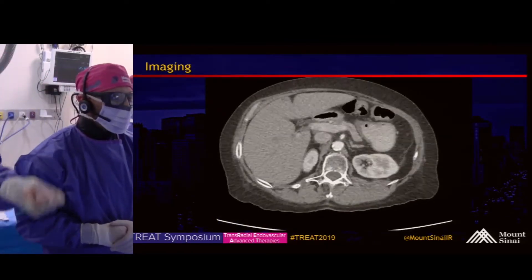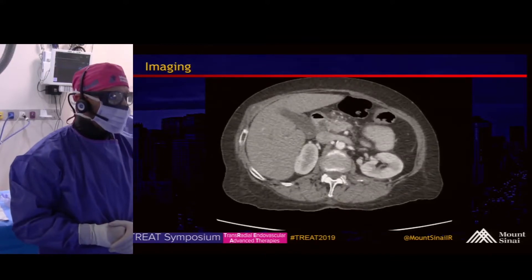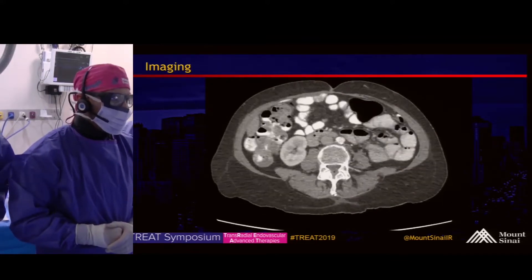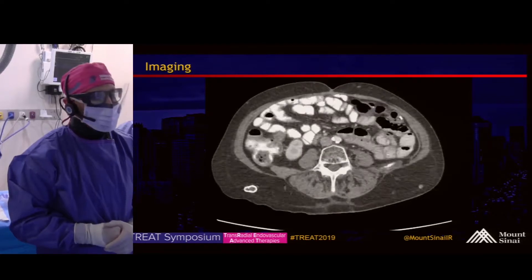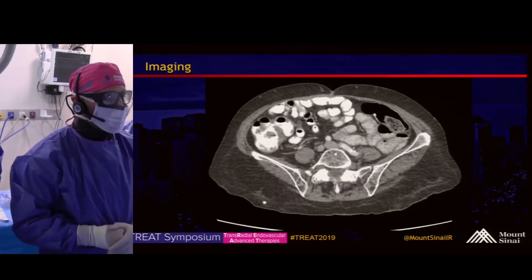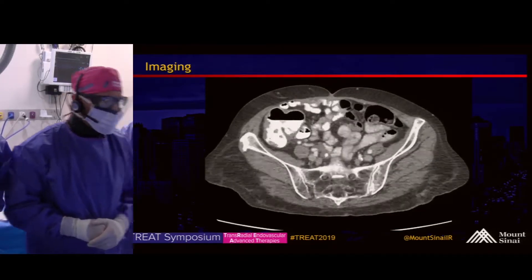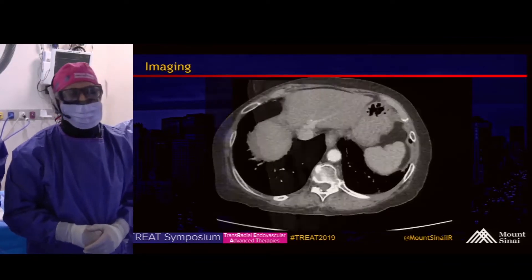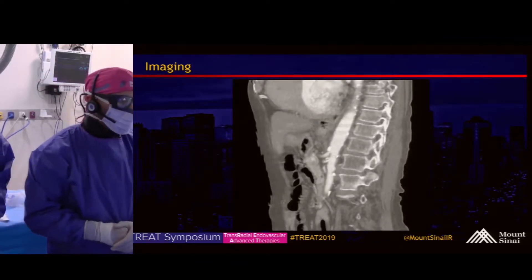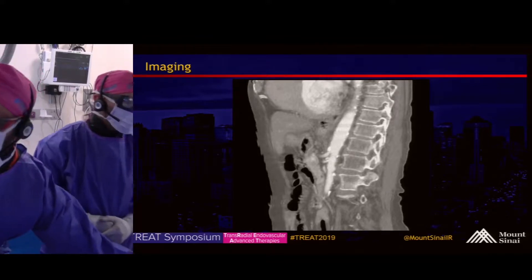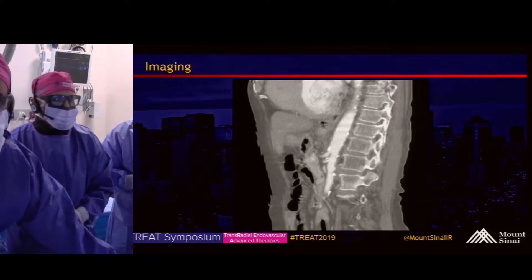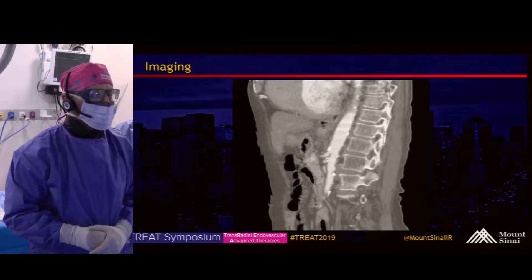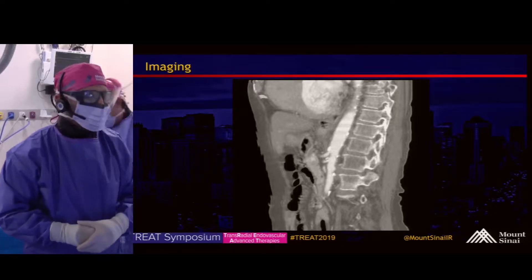Looking at this CTA, you can see a calcified stenotic SMA and calcium at the celiac ostium as well. Looking at the sagittal CTA of the SMA, you can see a pretty tight stenosis there with some calcium at the ostium, as well as at the celiac.